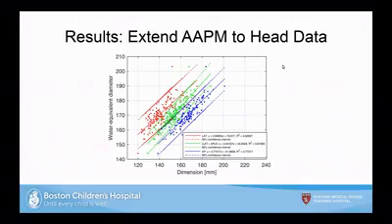So here I'm plotting the water equivalent diameter as a function of dimension, and this is the lateral effective diameter and the AP dimensions. There's fairly poor correlation between the lateral and AP, and since we combine the lateral and AP to calculate the effective diameter, we'll also have a poor correlation. This is because in the lateral direction, the ears protrude at different degrees for different patients. And for the AP dimension, the nose protrudes at a different degree for different patients. So that's why there's a poor correlation between the two. And then obviously, if you combine the two, you'll get poor correlation between that and the effective diameter.